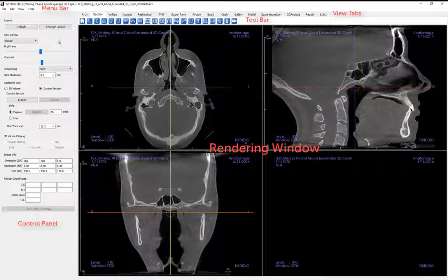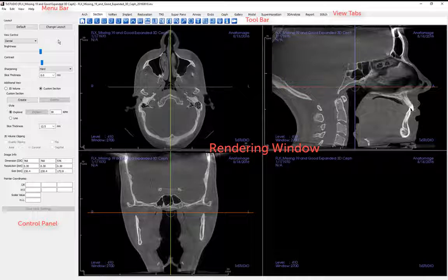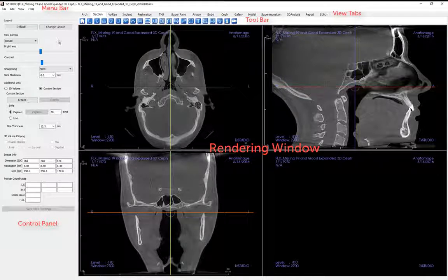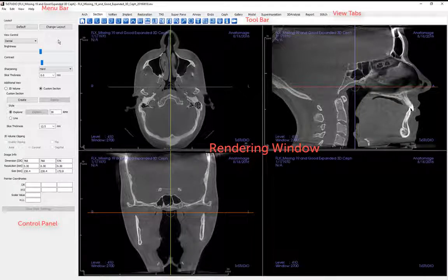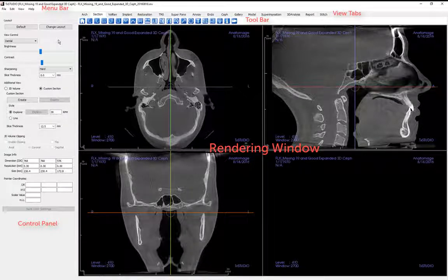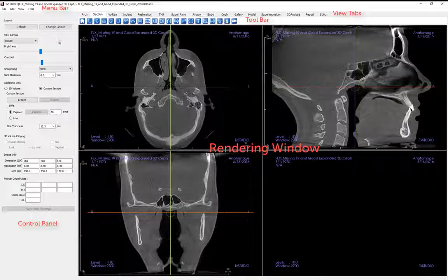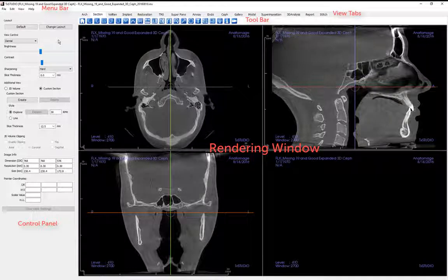For example, the section view tab gives you the ability to view orthogonal planes, create custom sections for 2D visualization, and to make distance measurements within the cone beam computed tomographic volume, or CBCT volume, if you wish.